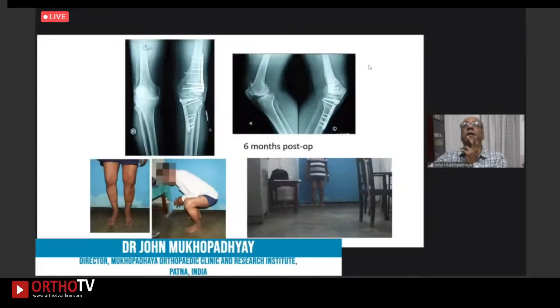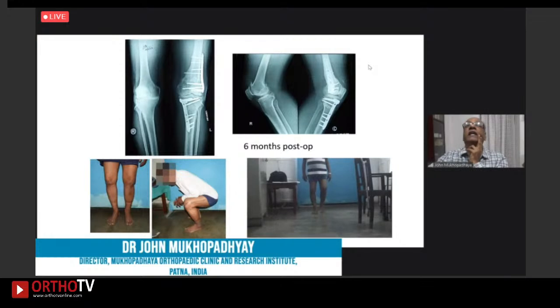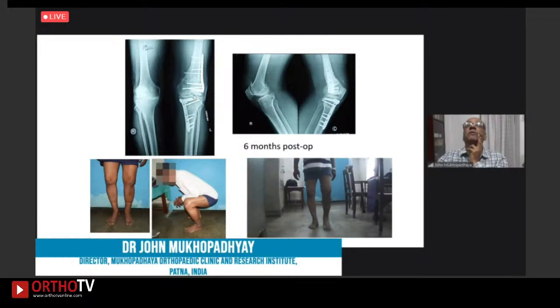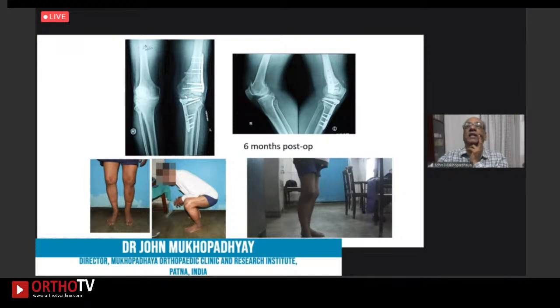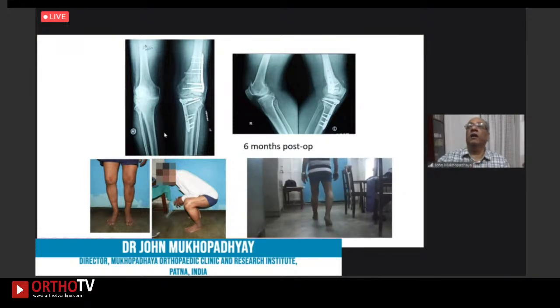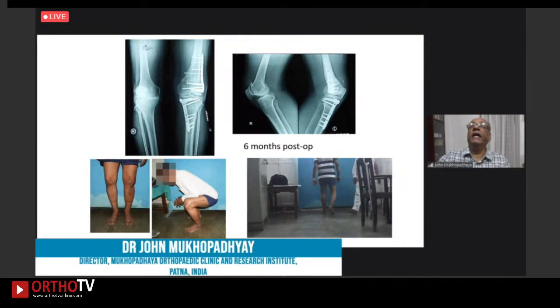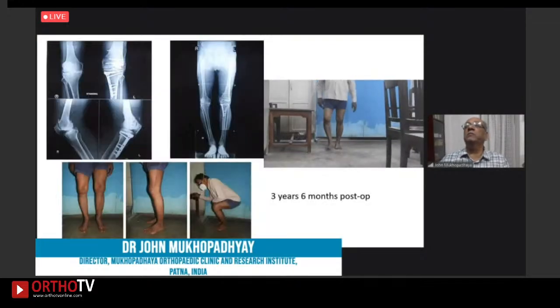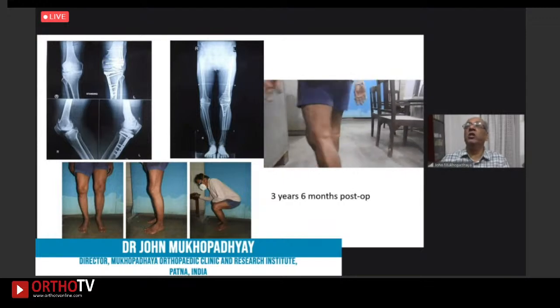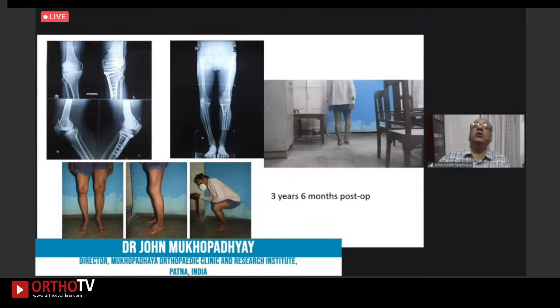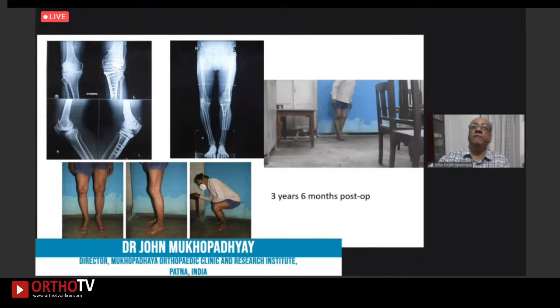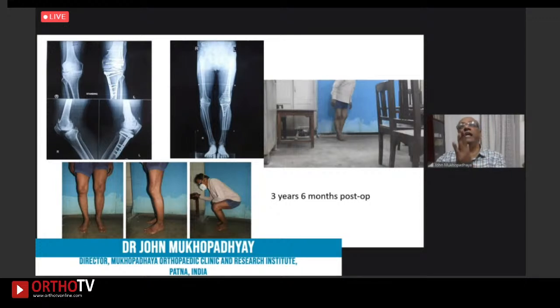At six months follow-up, the corrected knee looks a lot better than the opposite knee, which is now going into varus. At three years six months post-op, there is a varus thrust on the opposite side — an osteotomy has been suggested for that side, but the patient is waiting due to the COVID outbreak. You can see how the knee held out so much better on the corrected side because the alignment was adequately restored.